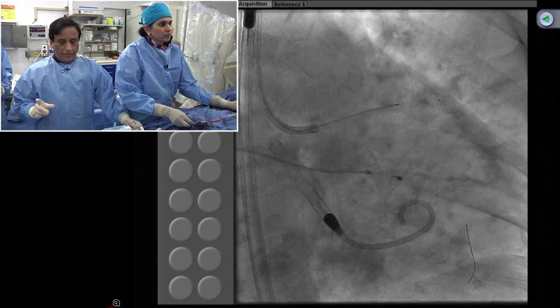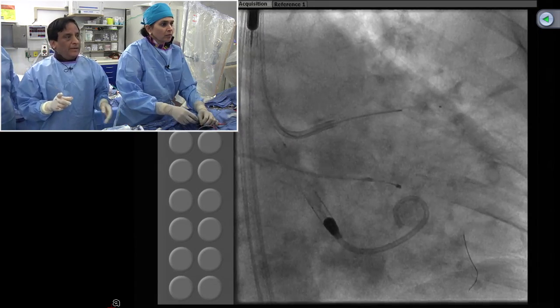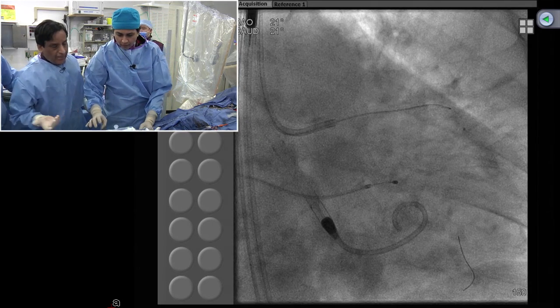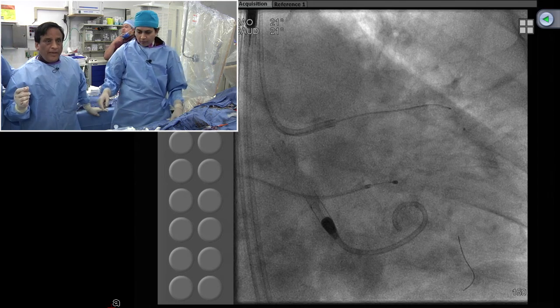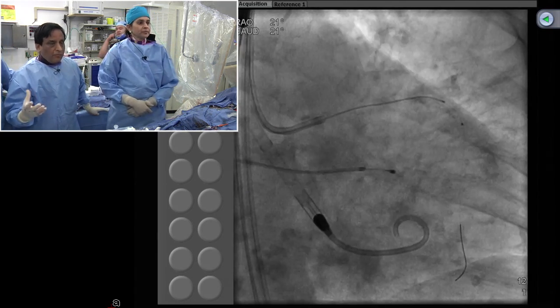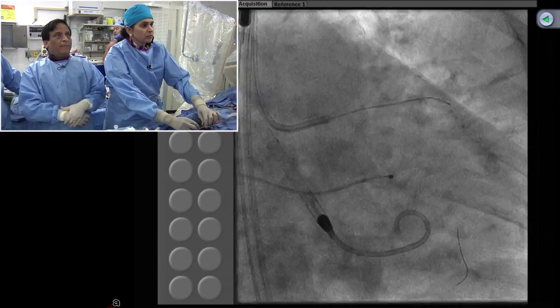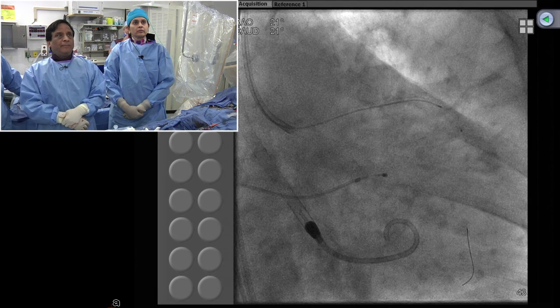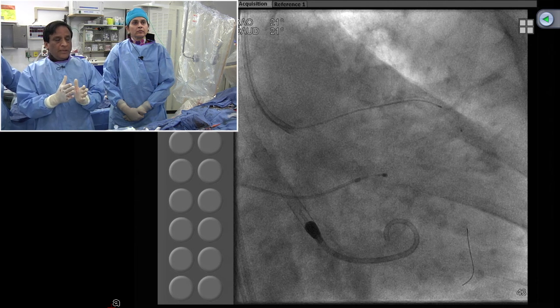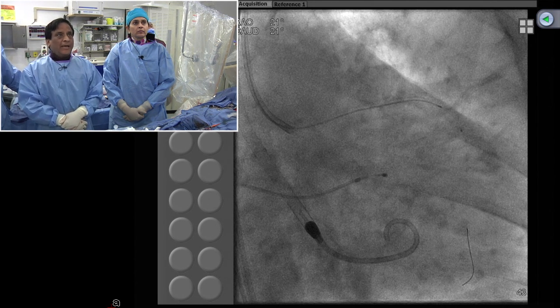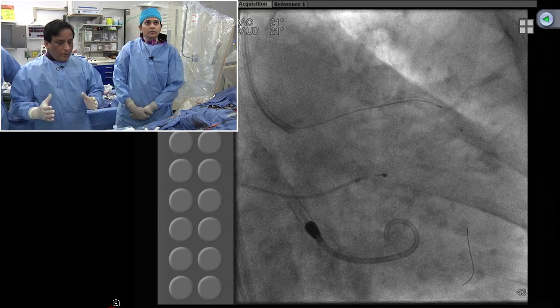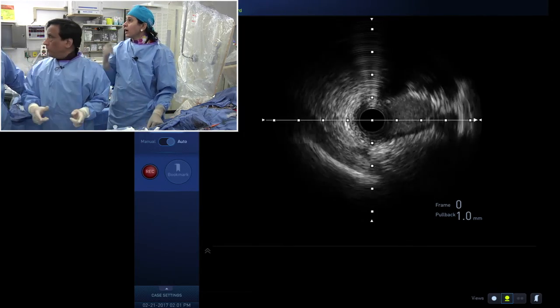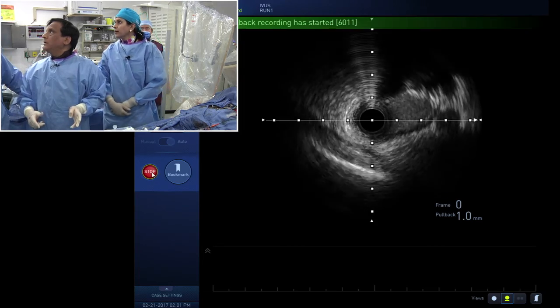We have published that orbital atherectomy cuts very deeply — we call it a gutter — and your stent really expands. We are doing many studies to show the OCT mechanism between the two techniques. The OCT has clearly shown that orbital atherectomy really cuts the plaque and the calcium into the deep area. Now we are ready — this is after the balloon — we will look at the mid LAD where most of the atherectomy was done, and we should see the classical snowman effect and separation of the calcium within the calcium.